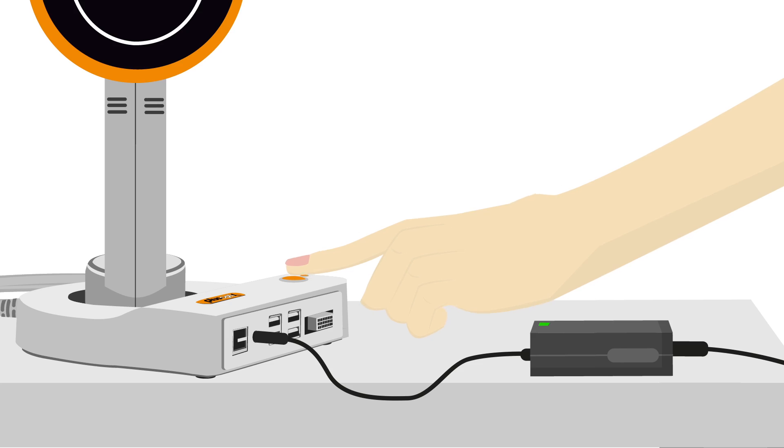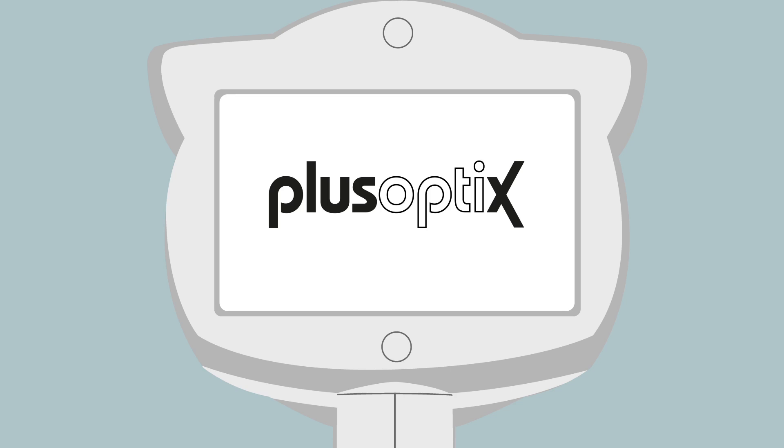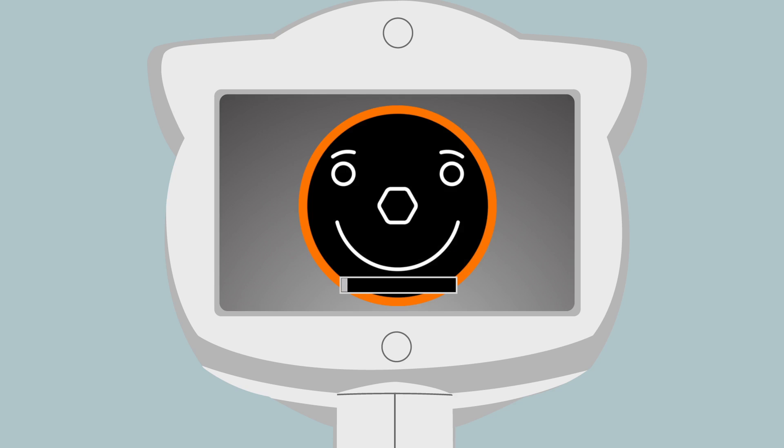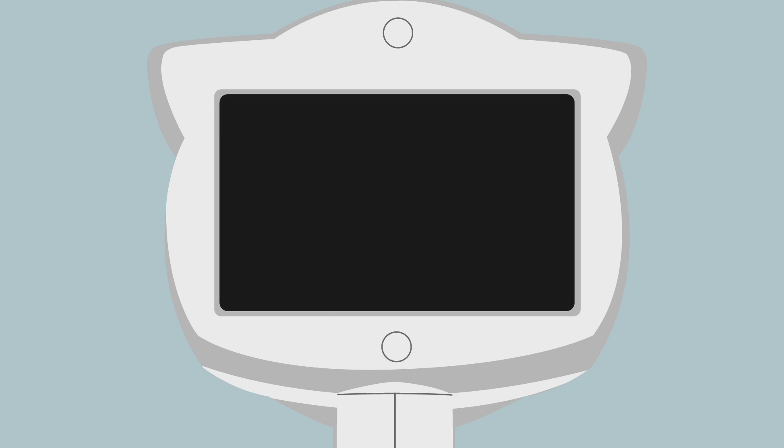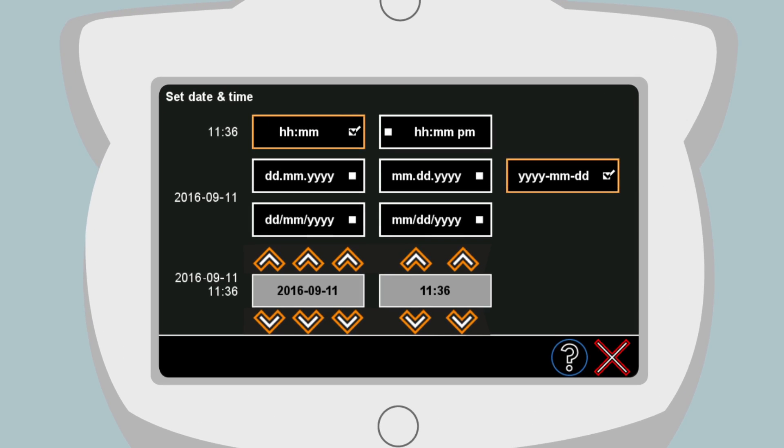Press the power button and release. It will take about 30 seconds for the PlusOptics device to boot completely. It is normal for the screen to go blank during the boot process.